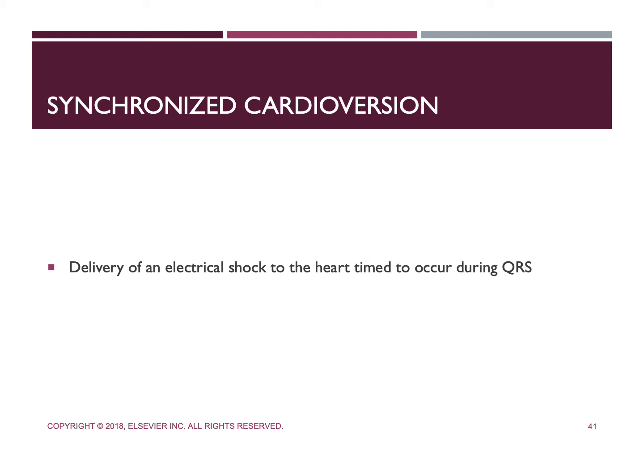Now, you heard me mention a synchronized cardioversion earlier in this lecture. A synchronized cardioversion is the delivery of a shock to the heart through a defibrillator, and that will terminate a rapid dysrhythmia. A synchronized shock means that the shock is timed to avoid the relative refractory period of the cardiac cycle. When the sync control is pressed, the machine searches for the QRS complex, and when it detects that QRS complex, the monitor places a flag or a sync marker on that complex.